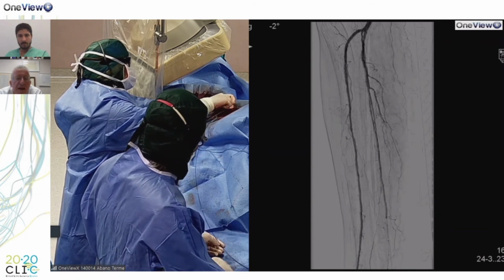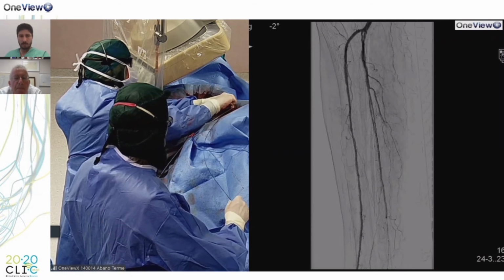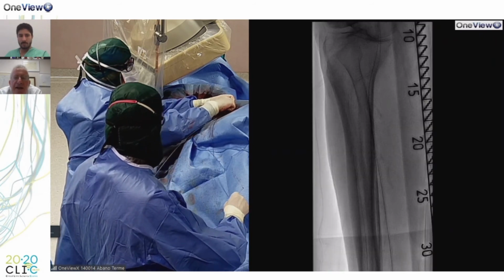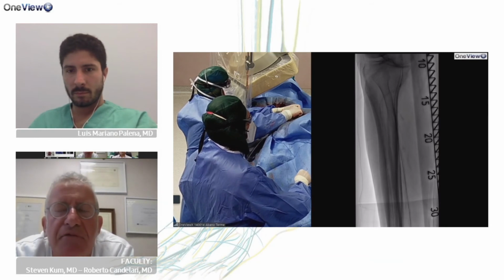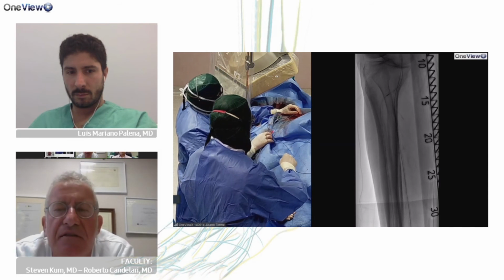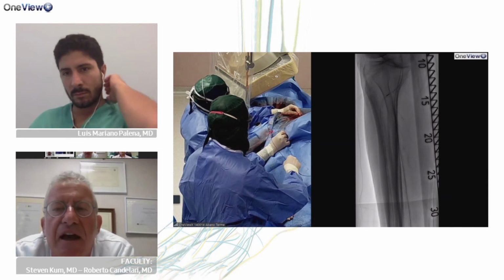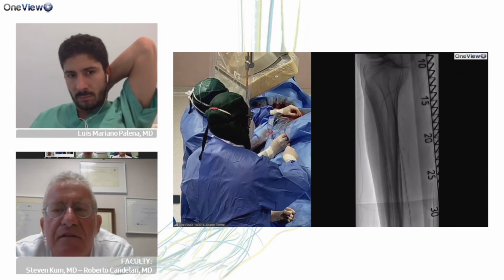And a question for Marco. Marco, can you hear me? Yes, of course. What's your feeling with the tip-loaded guide wire in a calcified tibial artery like this? Would you use this kind of guide wire?